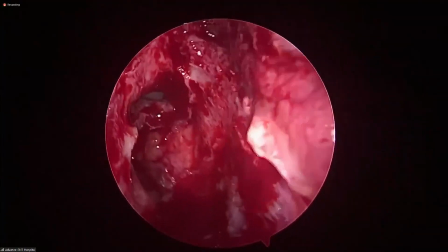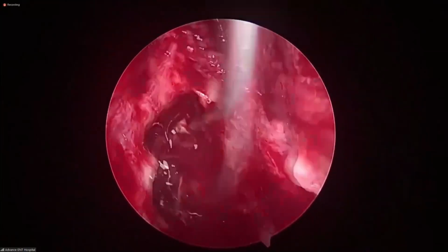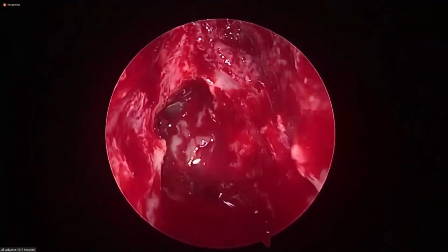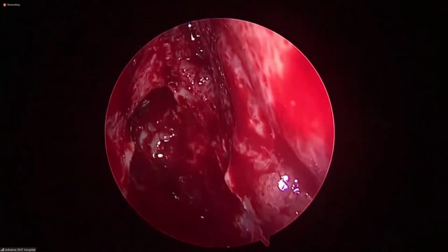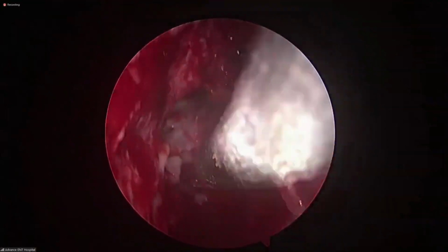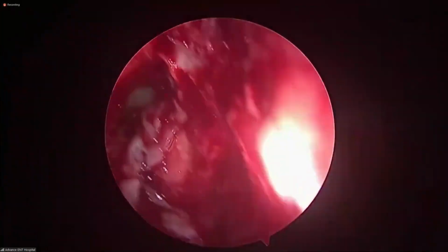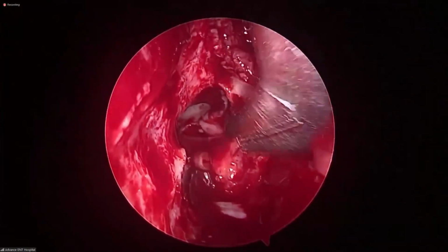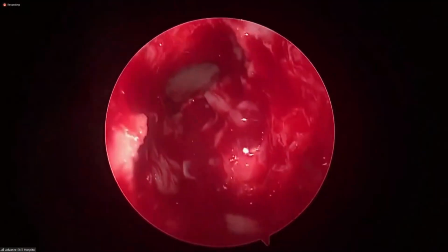See this cell. I will go and break it like this. See the cell which has come out? See the partition which has come out? You have to flush it with the skull base. This is it, and that is the frontal. Beautiful picture, sir. So this was the cell which was obstructing, which I am removing. And it was attached posteriorly to the skull base.